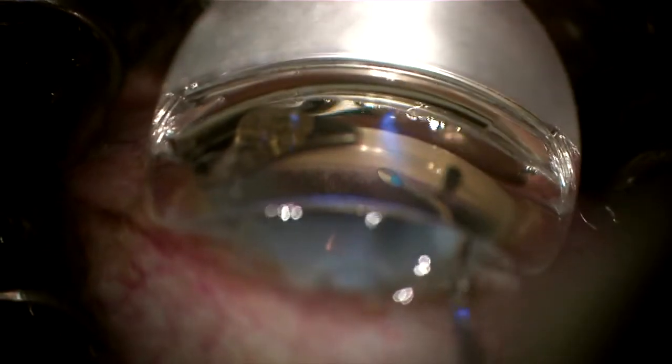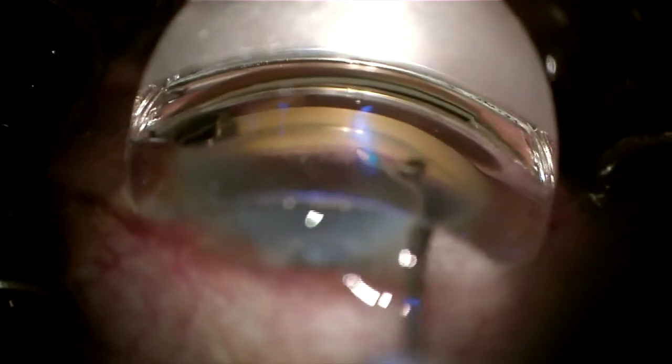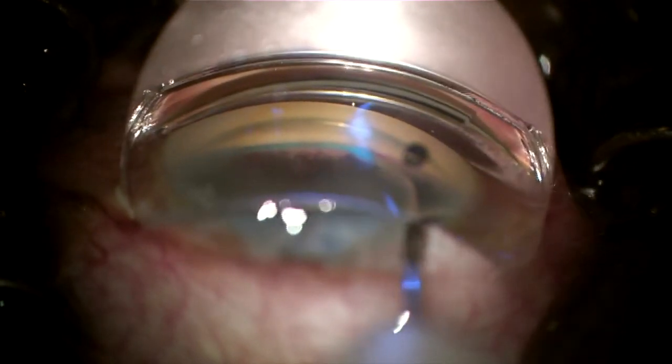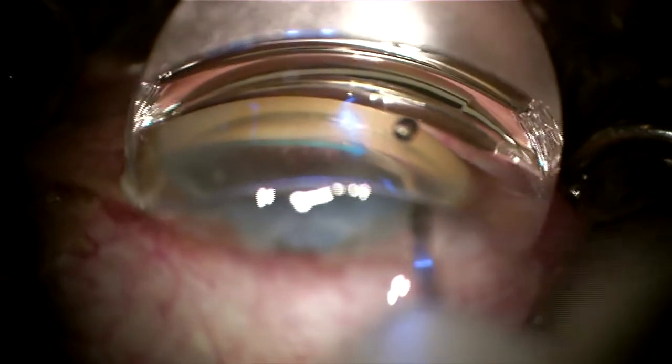Now here with the new Omni next generation device with that ergonomic tip. Making a small nick in the TM and pointing at about a 45-degree angle towards the trabecular meshwork. Advancing the wheel which releases the blue thread into Schlemm's canal. Once the wheel stops, I'm 180 degrees into Schlemm's canal.